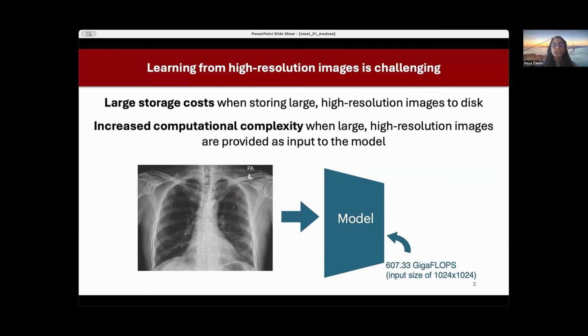And these kinds of issues will be further magnified when we also consider larger scale 3D imaging like MRI and CT. These issues are also very significant, especially as the use of computer-aided diagnosis tools becomes more and more common in clinical practice, as well as, as the recent talk just mentioned, newer paradigm shifts towards very large-scale foundation models that have very large parameter counts. So it's important that we address both of these issues as these kinds of models become more and more widespread.